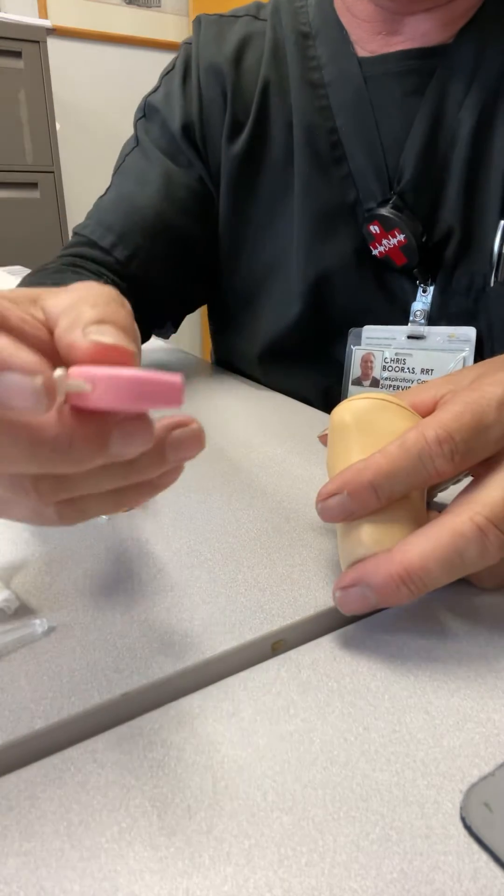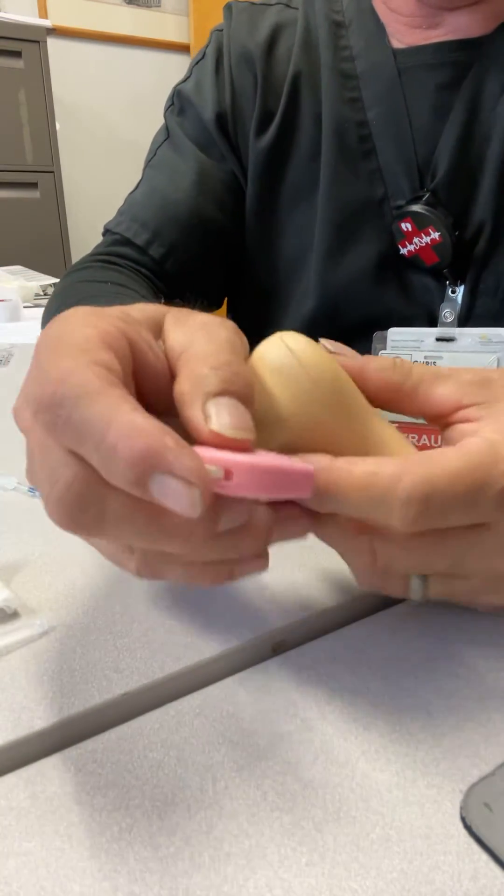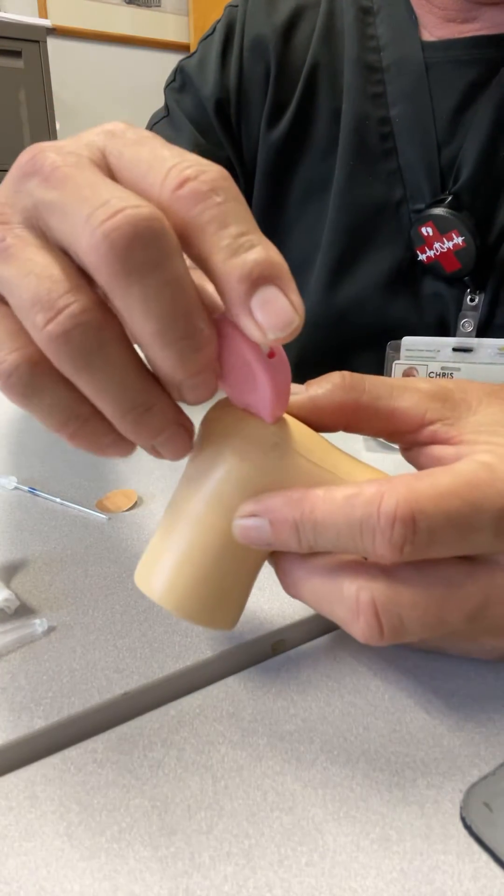Get your lancet. There's going to be a little arrow. The rule of thumb — no pun intended — is usually you put your thumb there and stick it.